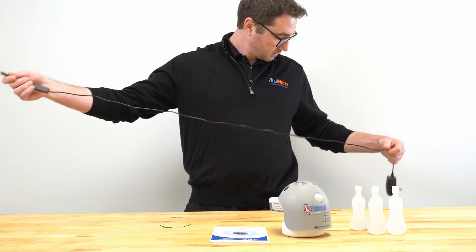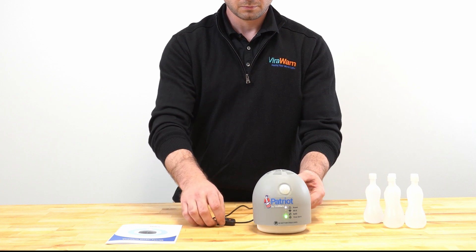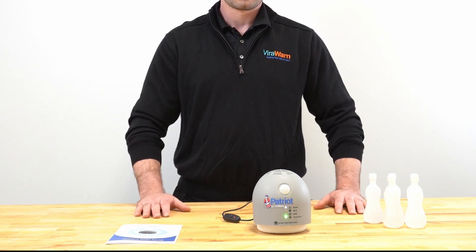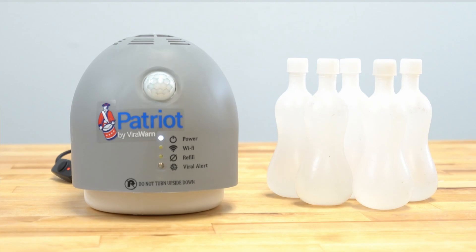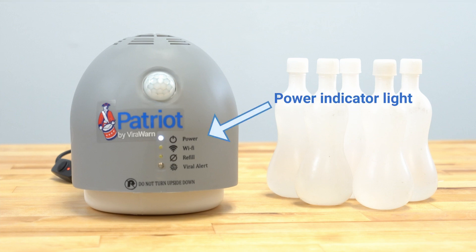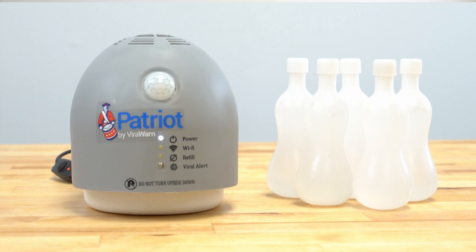With the device on a flat, stable surface, plug the power cord into a wall outlet and turn the unit on by switching the toggle switch to the on position. The LED lights on the front of the device indicate the state of various functionalities of Patriot by ViralWarn. The top LED light is the power indicator light, letting you know that the device is powered up and turned on. The light at the bottom of the device is the virus detection indicator light, which we will talk about more shortly.